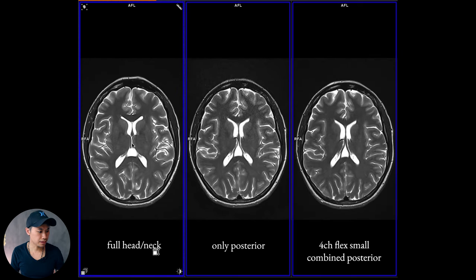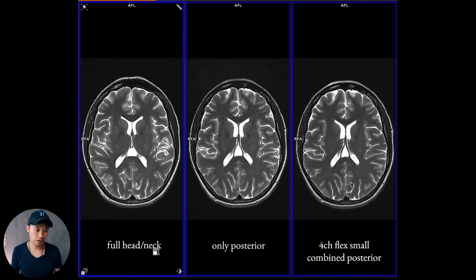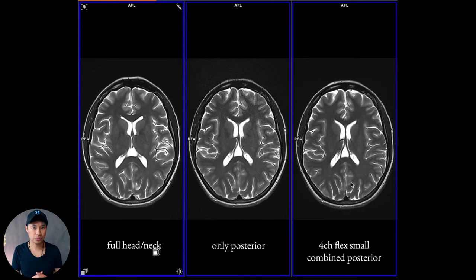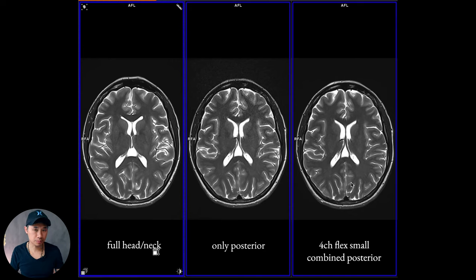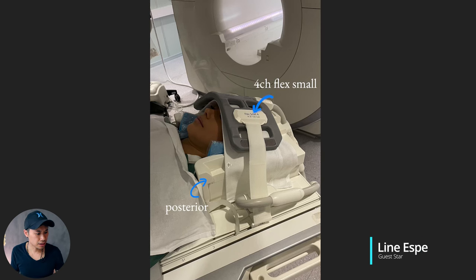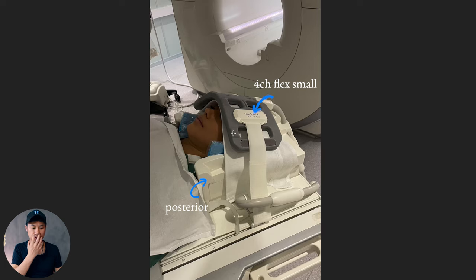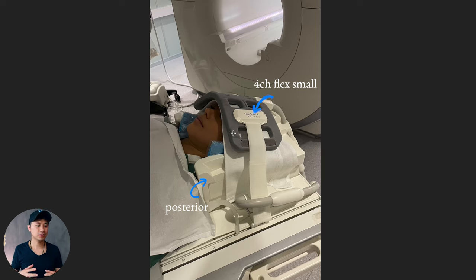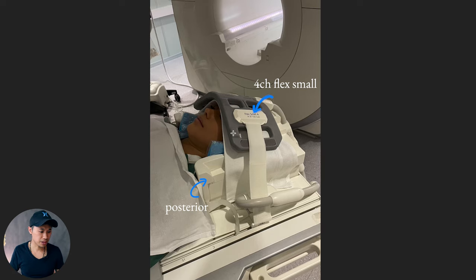It's very difficult to tell the differences between those two images. It seems good enough with the flex coil in front for cases like claustrophobic patients who don't want the anterior part in front of them, so it might be a solution. Also, patients who cannot lie all the way down due to kyphosis cannot have the front coil placed — so this can be a solution for those cases too.